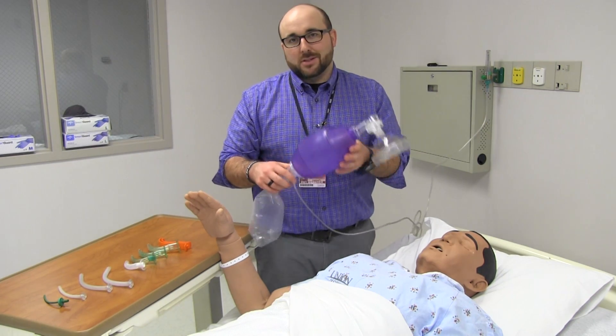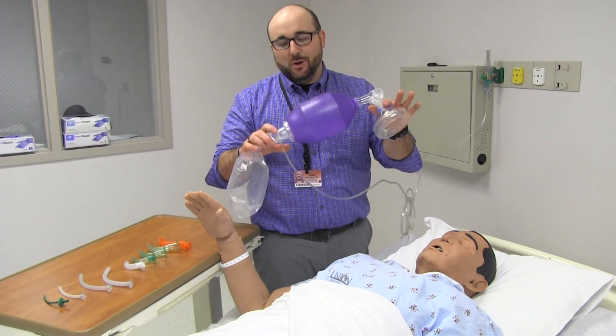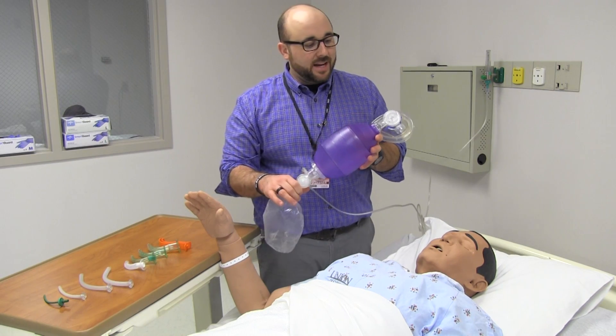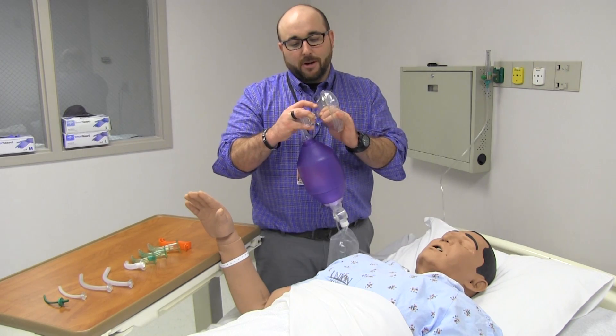The big key is this is a one-time use thing. We're not going to go around and use this on everybody in the ICU — we're going to get a new bag valve mask each time. You'll often hear this called by the brand name Ambu Bag, but that is actually a brand name, so we try to stay away from that. Bag valve mask is the best verbiage for it.